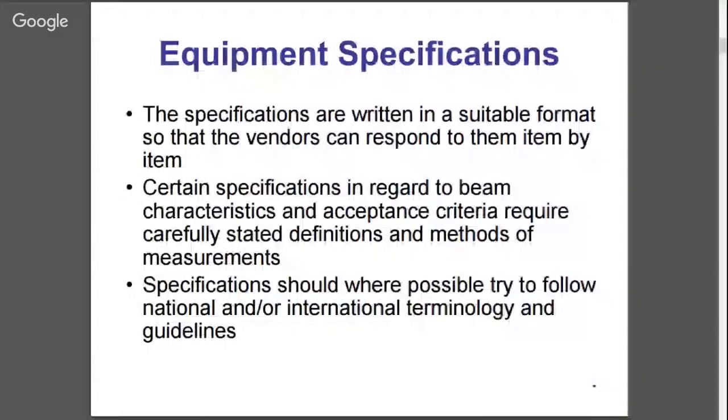This is particularly, I guess, the case if you're buying an accelerator in a department that already has a number of accelerators, and it's very important that your new accelerator matches the previous ones. Although saying that, these days accelerators are mostly very closely matched anyway. But you might have an older machine and you want your newer machines to match that. It's important that where possible, we also try and follow national or international guidelines and terminology. That way everybody is clear on what we're talking about.